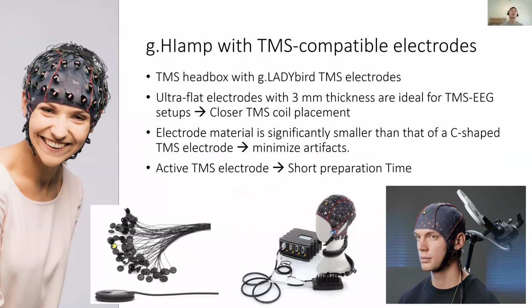Really popular nowadays is using EEG with TMS system. So TMS is a coil you place on top of the brain. There's an electric current going through the coil, which induces electric current inside our brain for brain activation. People use it for rehab purpose and different types of brain research for brain activation and EEG monitoring.